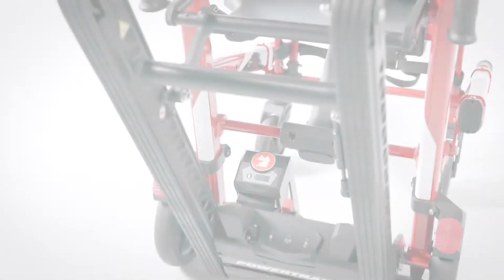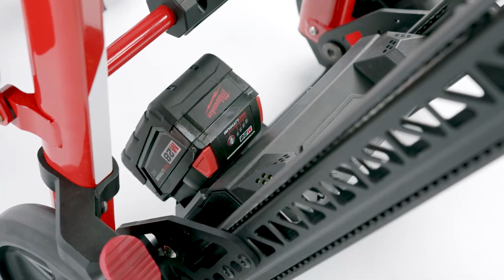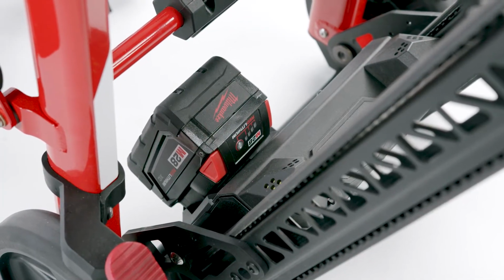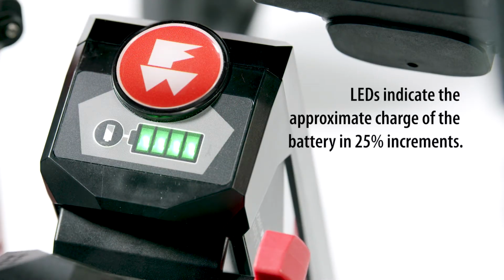The Transcend with PowerTraxx comes equipped with an EnduraCharge or Milwaukee battery. To check the charge in the main battery, push the battery check button. The LEDs indicate the approximate charge of the battery in 25% increments.